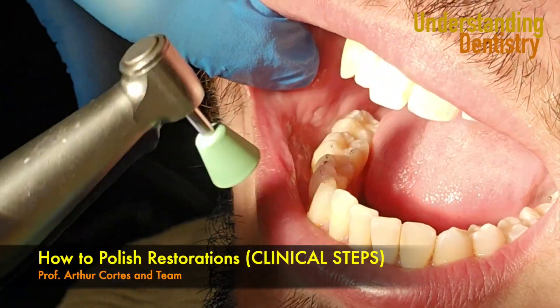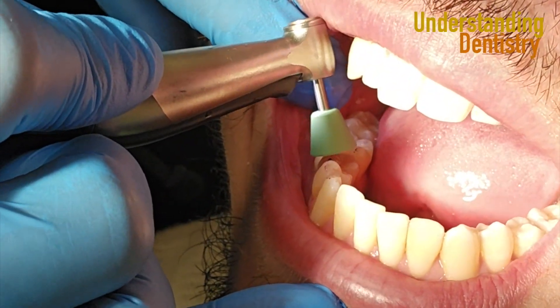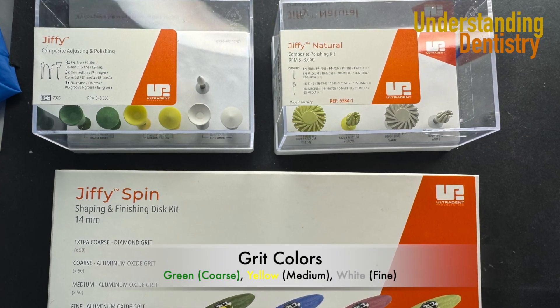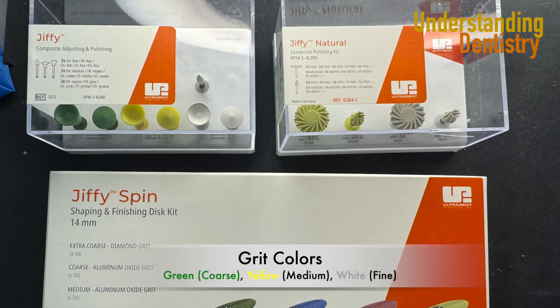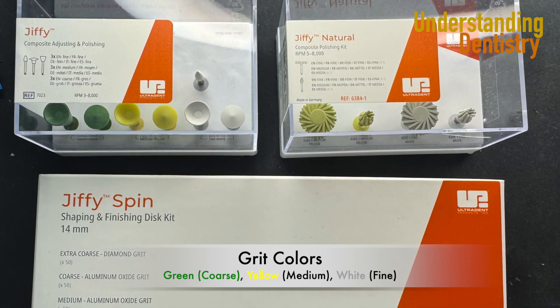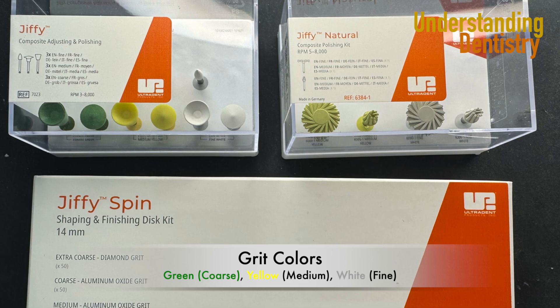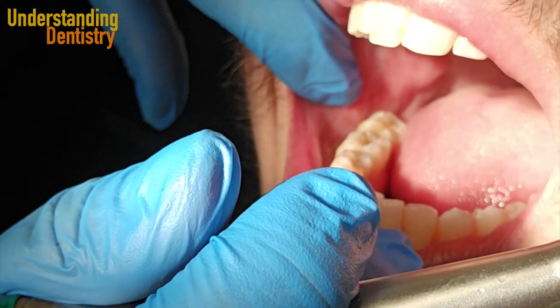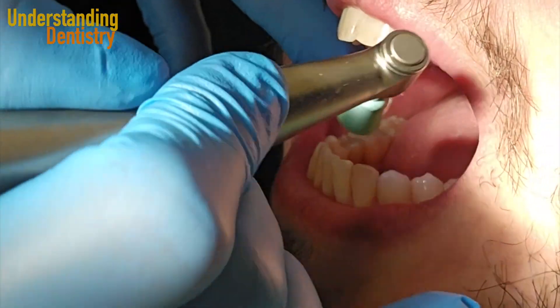Hello guys and welcome to this video to see how to polish restorations nicely. Here we are using the Jiffy, the one on the top left corner from Ultradent, but if you can have all these polishing kits, even better. So you just finished your restoration because there were overhangs or because you were adjusting the occlusion, and now you need to polish your restoration.